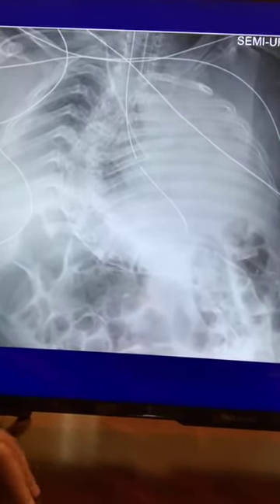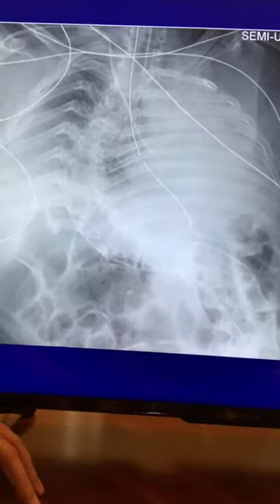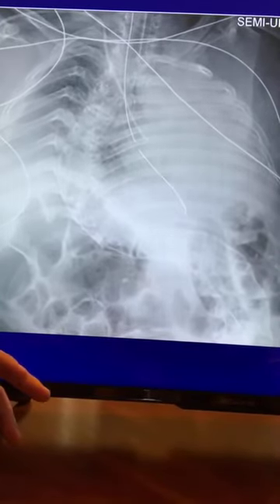So that messes up a lot of stuff internally, right? The body is now naturally contorted into a very unique position. So now as a radiologist, you need to figure out where the normal structures are abnormally placed. You have a couple of context clues to help you figure that out.